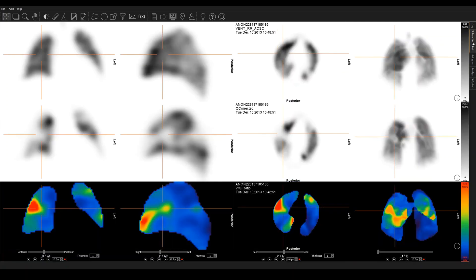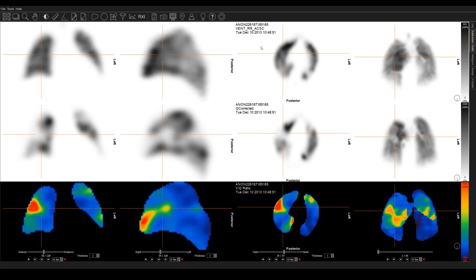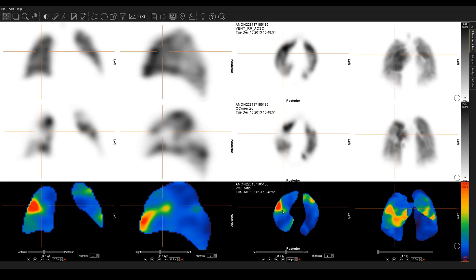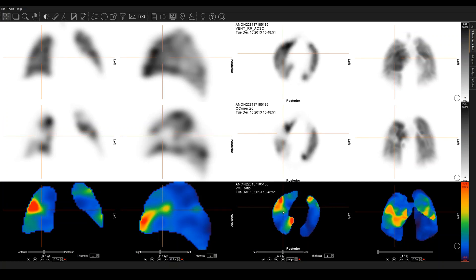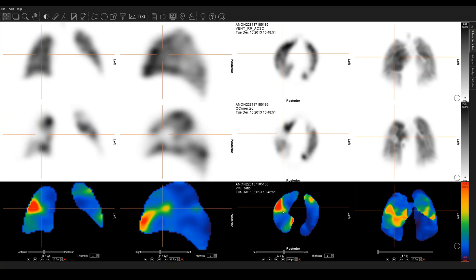On this tab here, what we're showing, so ventilation as before on the top. Q corrected, this is the perfusion SPECT. But any remaining counts from the ventilation, if two technetium agents were used, they have been subtracted out from this to correct for any possible overventing. And then this image down here is the ratio image. So it's the ventilation divided by the perfusion to really show up and highlight those mismatched defects.